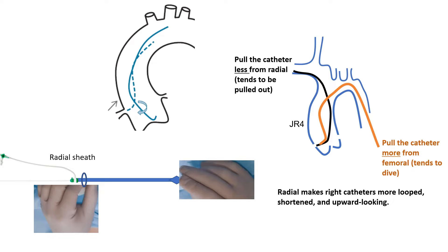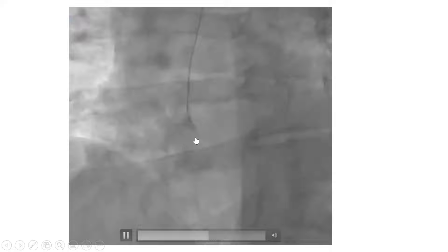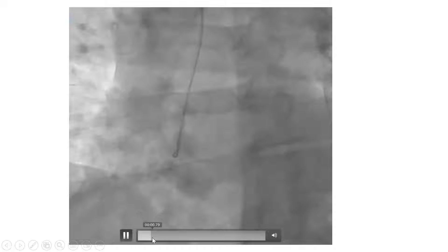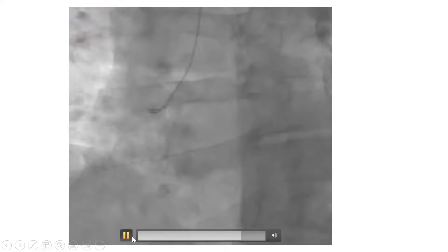From radial, you tend to fly up; from femoral, you tend to dive down with your Jutkins right 4. Here is the technique illustrated: you touch the valve, then pull with clockwise torque and get right in. On fluoroscopy, it's hard to tell where the valve is — that's why you start by touching it. Then pull with a clockwise torque — it's 1 to 1.5 centimeters above the valve.